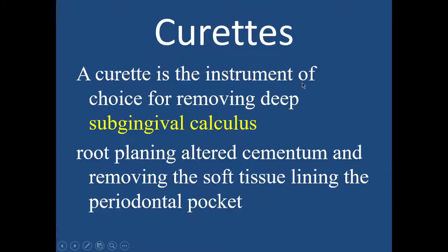It is curettes. Yes. The curette is another instrument used for removing deep subgingival calculus, for root planing and removal of diseased areas. It's a very important instrument, and you will see outside college that many doctors do not use the curettes for their ordinary work.